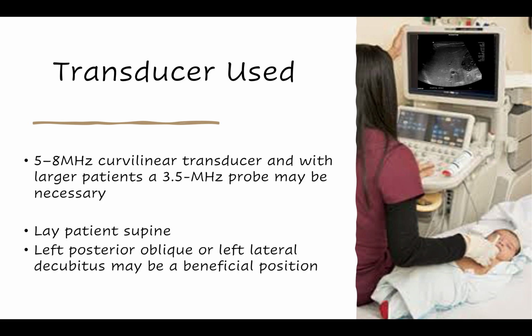For this exam, you will use a 5 to 8 megahertz curvilinear transducer, and with larger patients, the 3.5 megahertz probe may be necessary. You will lay your patient supine. Left posterior oblique or left lateral decubitus may be a beneficial position.